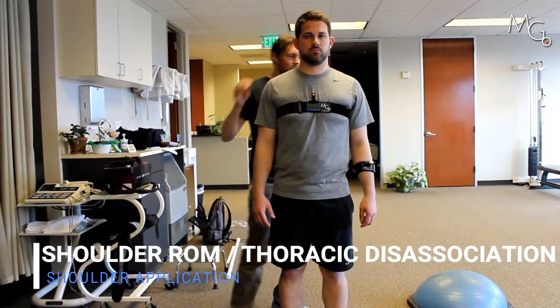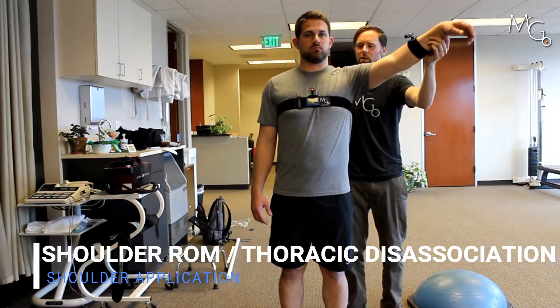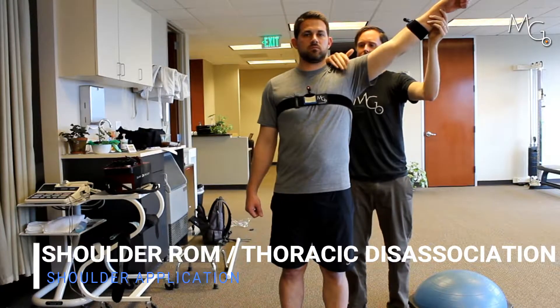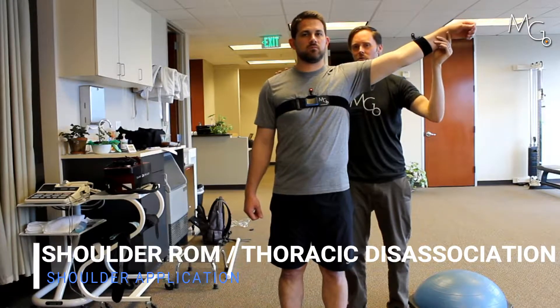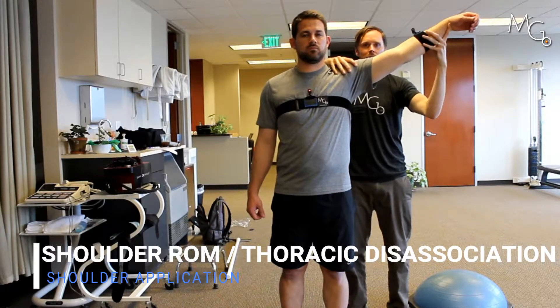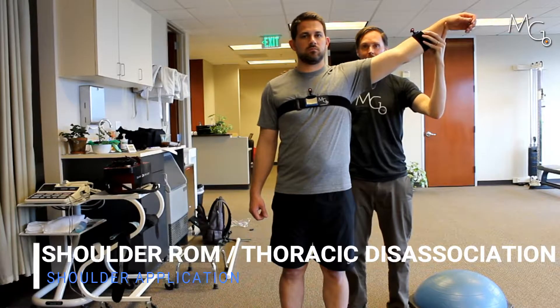Then we're going to bring the arm to where we want it — so let's say we're doing that Y abduction position — and we're trying to get a pure amount of extension here without Chris rotating his thorax to get the motion. I'm going to bring this out to here, turn on the second laser, center that up as well, and then come back down.